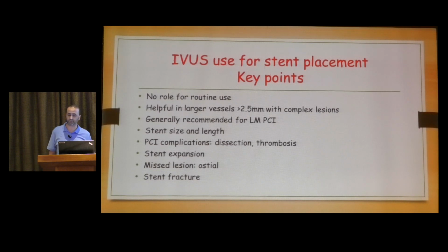IVUS used for stent placement. There is no rule for routine use. We don't need to use IVUS for every case or every one we do. Maybe it's helpful in large vessels because that can help us size our stents. We generally recommend it for left main PCI interventions. I'm going to show the data about that.